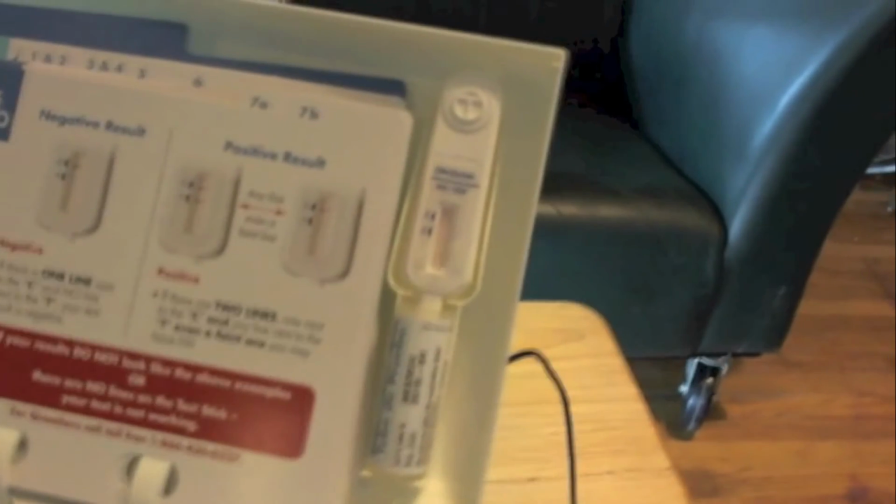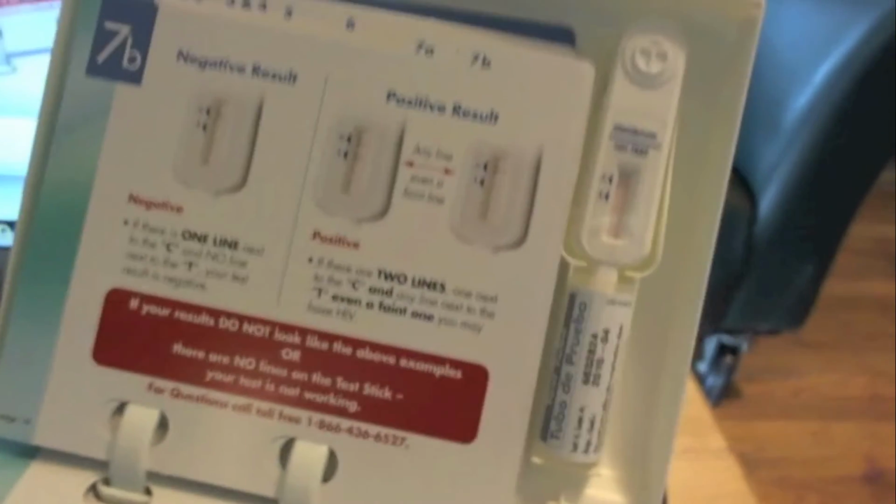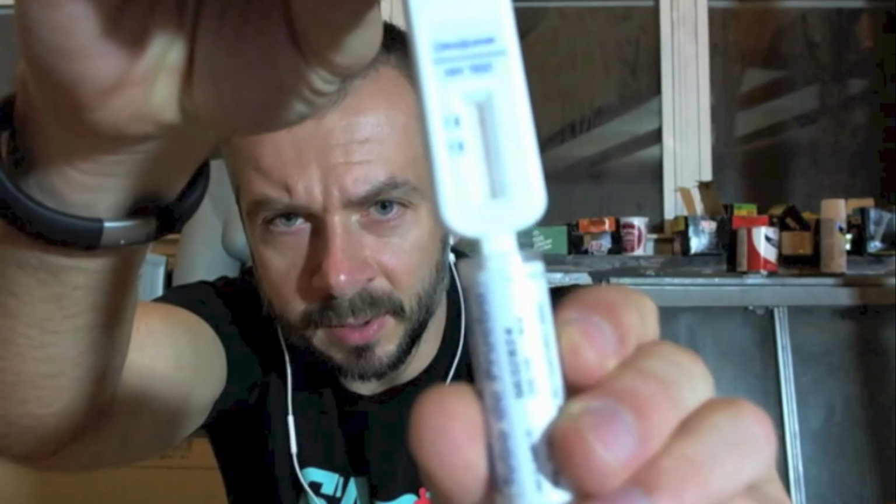Okay, 20 minutes have passed and it's time to look at the results of the test. So this is what the actual test kit looks like, and these are my results. So test tube, and as you can see, you're supposed to have a line at the C, but not at the T. That means negative result.